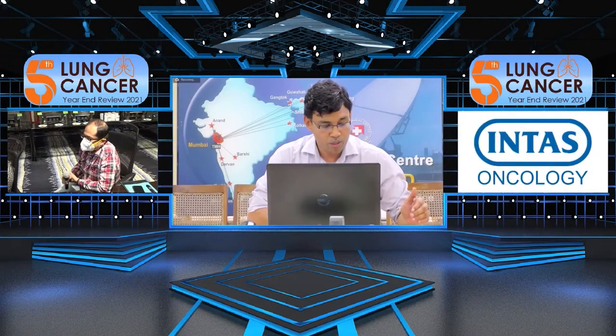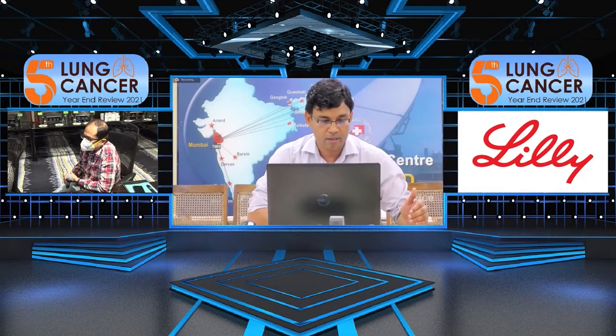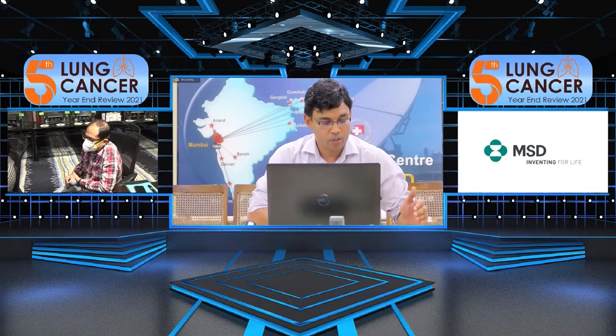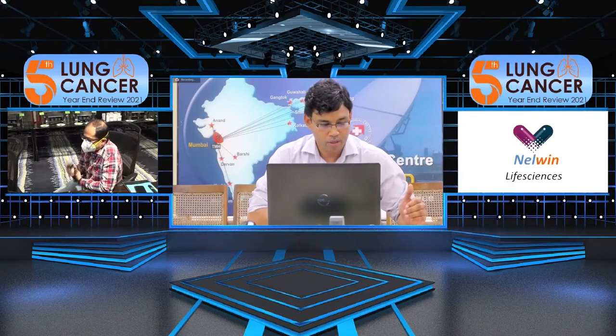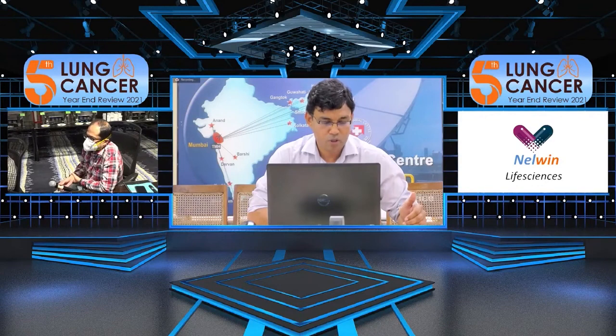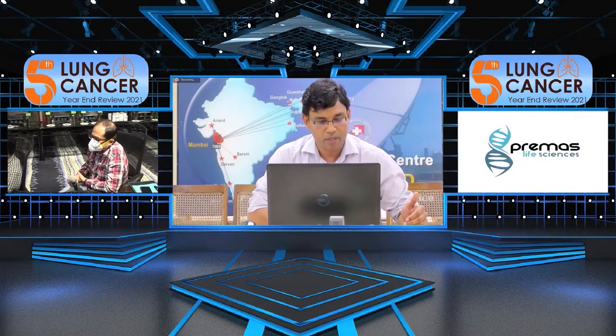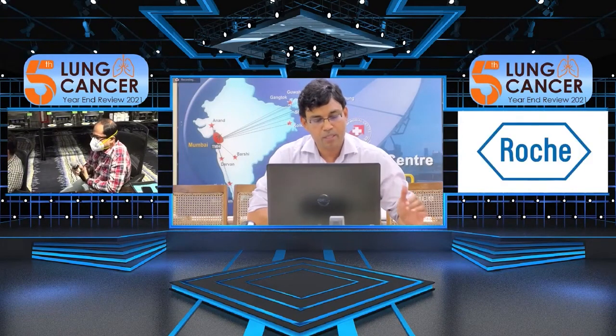If we cannot give contrast, then it is better to do a plain MRI scan. That is better than NCCT, because NCCT is going to miss small lesions as the resolution is not that great. By definition, MRI has to be done with contrast. If for certain reasons we are not able to give contrast, then we will do a plain MRI brain, and CT will be the last resort.